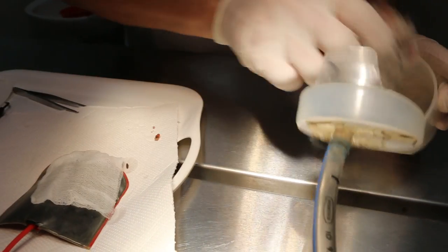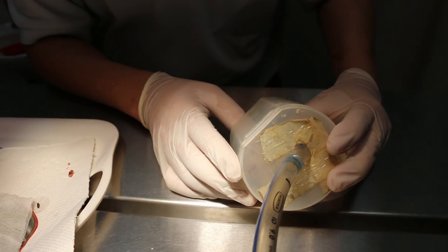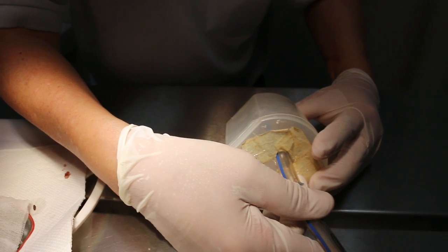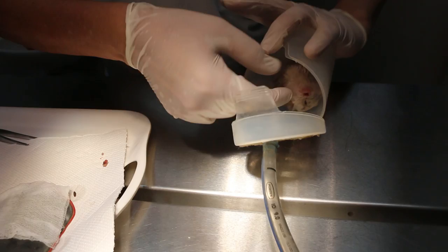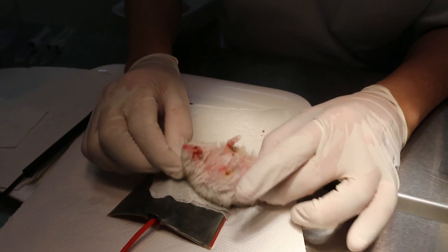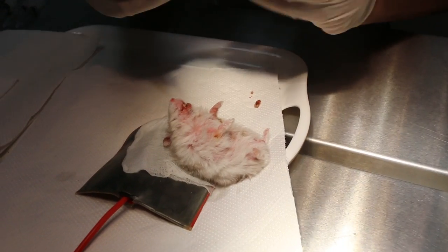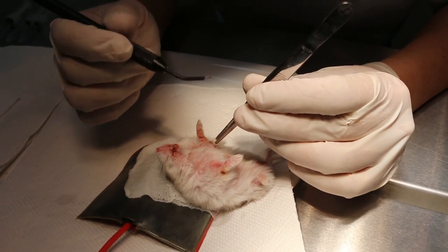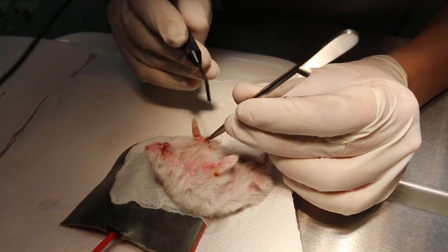Now, as I said, we have to tell how deep it is, so I put it back again. 1, 2, 3, 4, 5, 6, 7, 8, 9, 10. The other vet didn't want to operate because of the, I guess, the warts around, so the owner left it as it is. So now there's another small wart here, which is better removed. In fact, here there's still another wart.